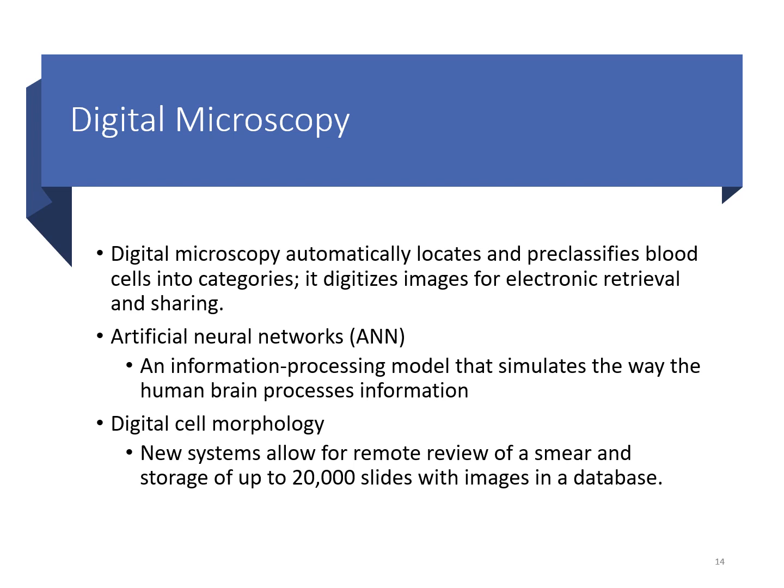And then from there, the tech will review those images to make sure it looks like they were placed in the right category. I've never used one of these, but I have heard from other students, and I have seen them in some clinical sites. The consensus is that it's great. It saves time, but it also causes a little bit more work for the tech because it doesn't always classify the cells properly. But this is a newer technology, and you probably will at some point in your career start seeing it a little bit more.